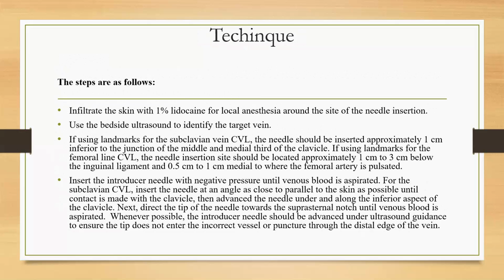The steps are as follows. First, we have to infiltrate the skin with 1% lignocaine for local anesthesia around the site of needle insertion. Use bedside ultrasound to identify the target vein whenever possible.